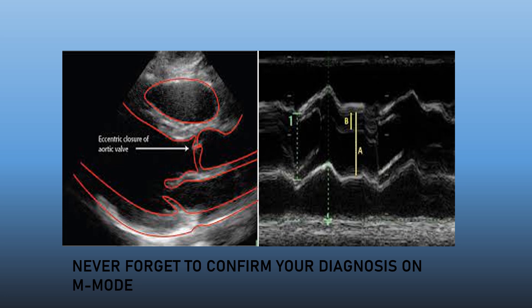Once you are sure about your diagnosis, it is always better to confirm with a contributory finding from M-mode imaging, where the eccentric closure can give additional support to your diagnosis. This eccentric closure of the aortic leaflet is a very important contributory finding from M-mode imaging, and you must take the help of M-mode for diagnosis of the bicuspid aortic valve.